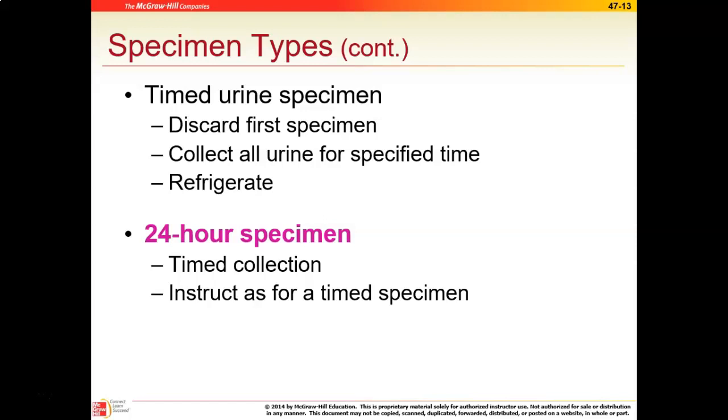If you send somebody home with a timed urine specimen, it is okay for them to put the samples in a large container in the refrigerator with the cap on because you want to prevent any bacterial growth from occurring.